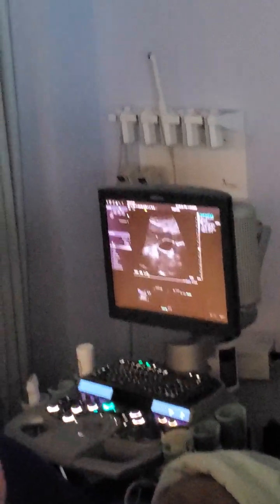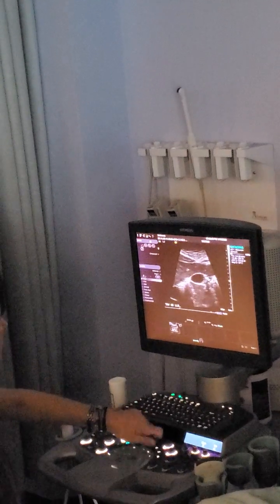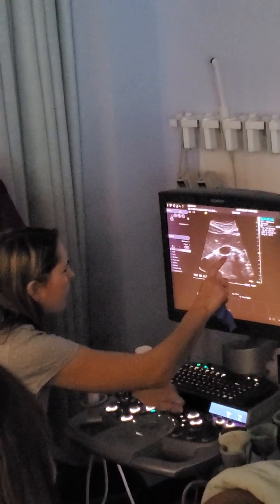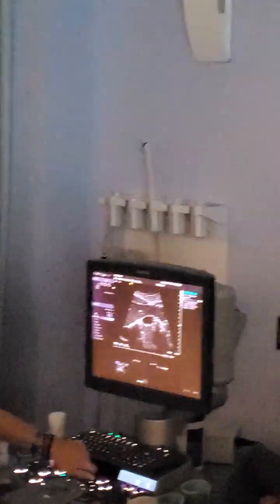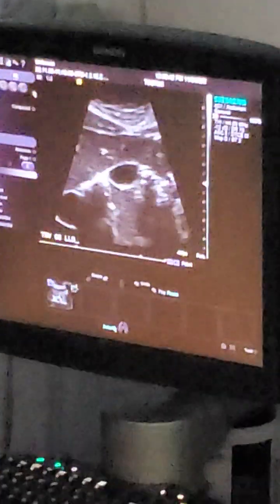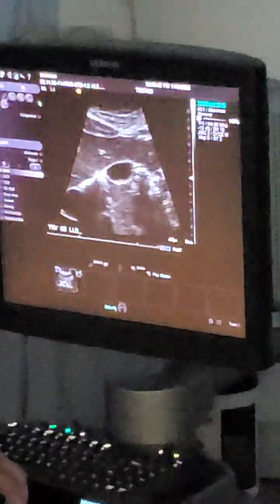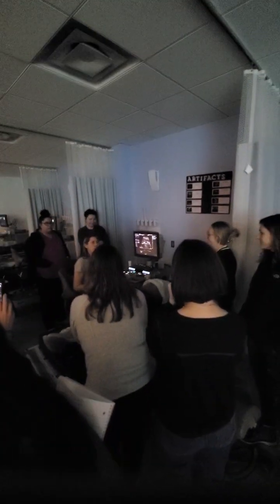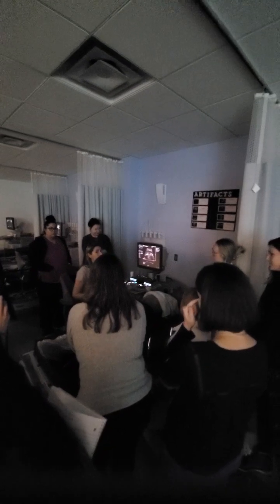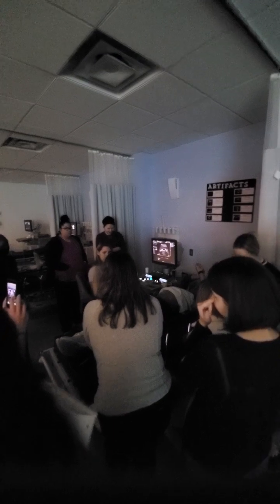Any questions? Can you see it on this? No. I didn't really see what you meant by it. It's going to be right here. See how it's in and out? Yeah, I saw it at first and then I didn't know what you meant. It's like a ghost. And do we need to take 3 in LLD for transverse? I believe your protocol says 2 transverse and 1 sag in LLD, but double check your protocol. Okay, I'm going to lower you down so you don't fall off the bed. Knees out of the way, everybody.